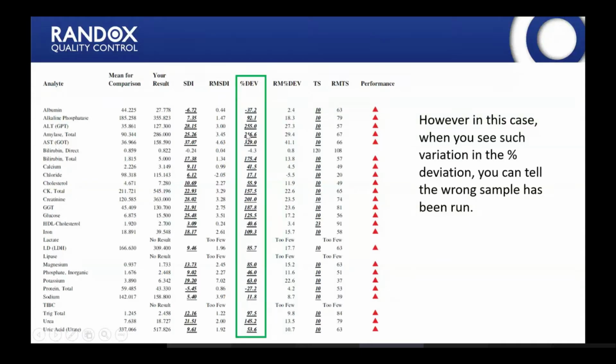When the percentage deviations show such variability, then we can assess that this has been the wrong sample. Either the lab have run the wrong sample and submitted the results for the sample they ran, or they've submitted the results under the wrong sample number on the RIQAS net when they were entering the results. But it's the wrong sample that has been assessed. So these results are not for the sample that's shown here.